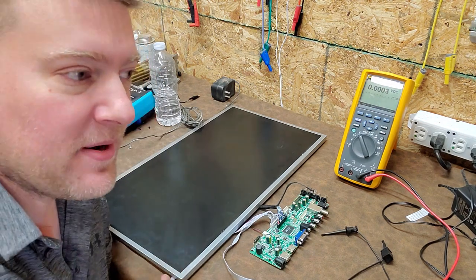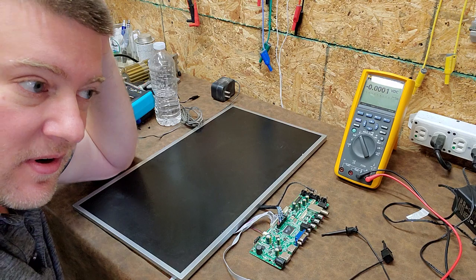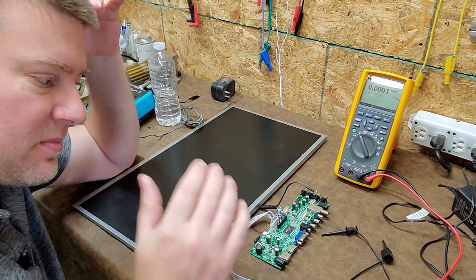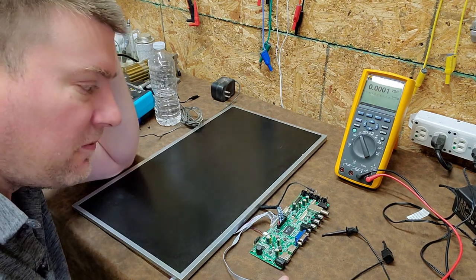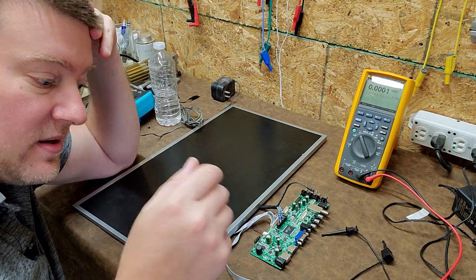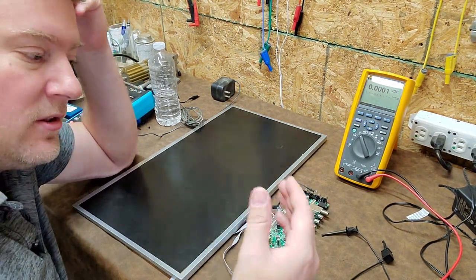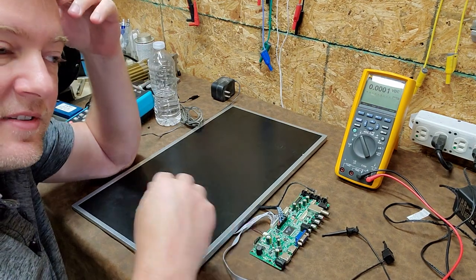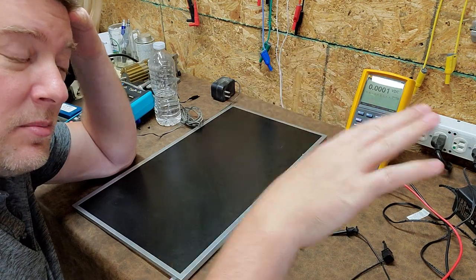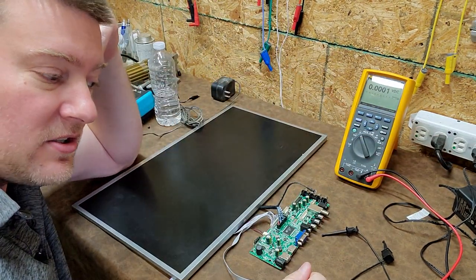Today I've got a medical display, or at least that's what I'd like to think of it. It's really just an RCA TV, but it is technically a medical display because this particular model runs off 12 volts DC. So there is no 120 volt AC input on this display whatsoever. The reason that they run it off the lower voltage DC is because it's much safer to run the cabling up through booms. And I do believe that this is the kind of display that sits down near the patient.